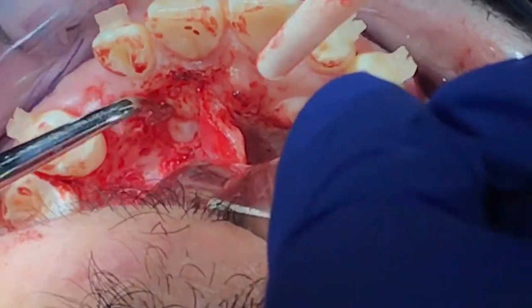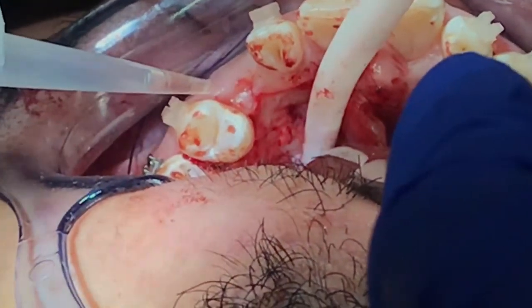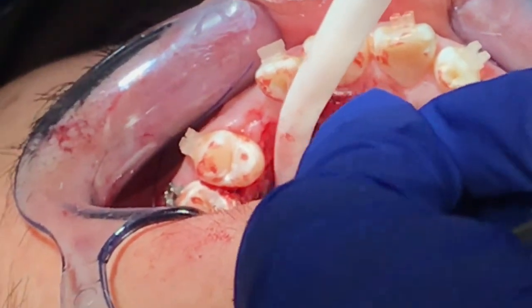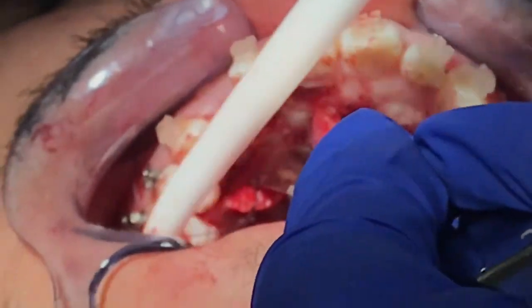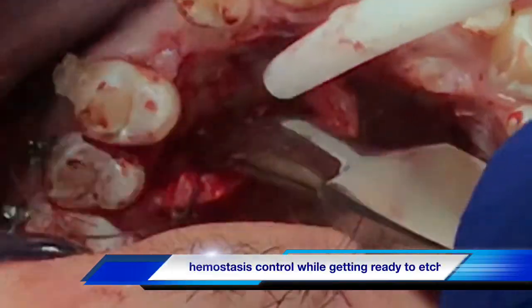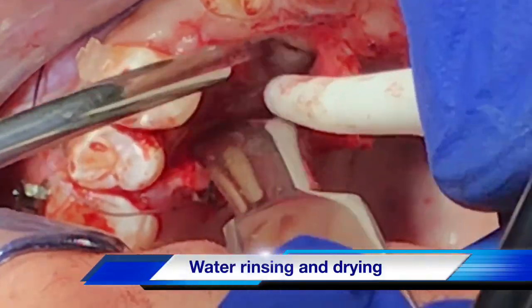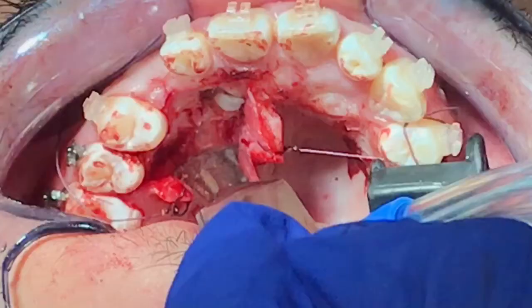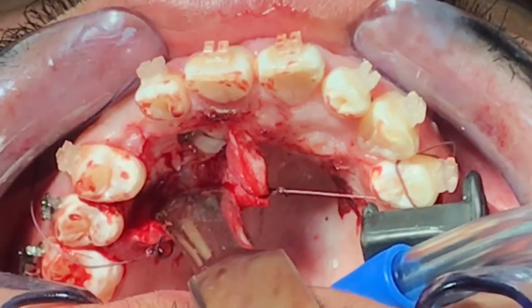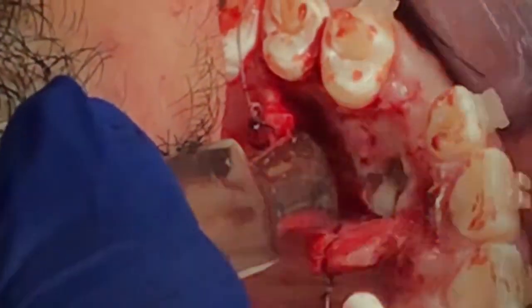We must define the area really well and get ready for bonding device application. During this procedure, there is bleeding. Therefore, we attach the gum with sutures to separate them apart and isolate the area really well.